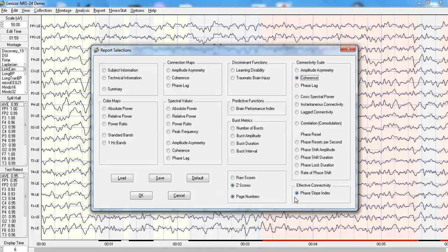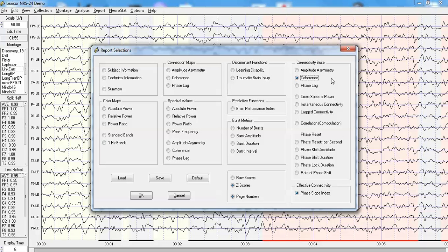You'll be able to see that in the case of coherence, that's a measure of functional connectivity in which there is diminished connectivity or reduced connectivity in the right parietal lobe. We'll see the negative z-scores in the right parietal lobe in this patient because the patient has damage to the right parietal lobe.